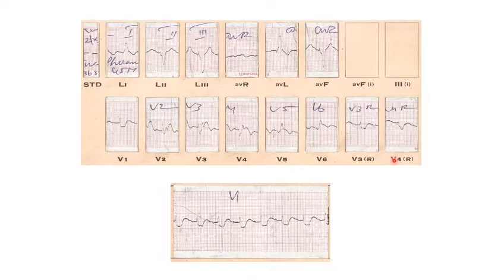In a patient with myocardial infarction, what is the evidence of infarction? Yes, you are right. Q wave: is it an early event or a terminal event? Early event. So in a patient with right bundle branch block, the early part of the QRS is not altered. So when myocardial infarction occurs, which is detected by alteration in the initial part of the QRS morphology, it can be easily diagnosed.